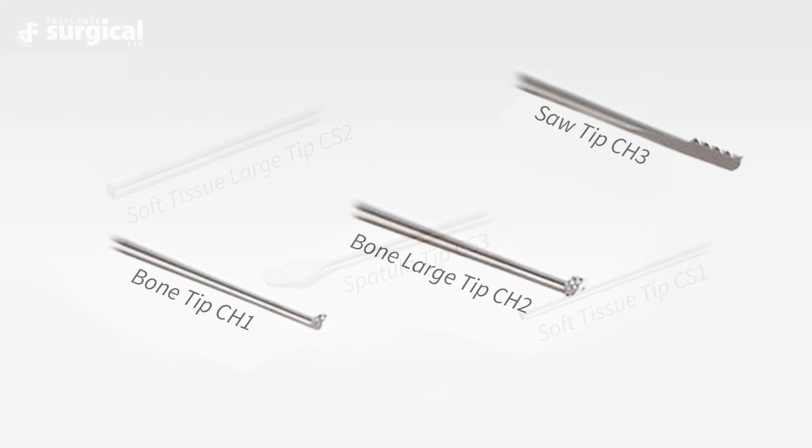For hard tissue orthopaedic surgery, there are again three different bone tip options. We have the standard bone tip, we then have the large bone tip and also a saw tip. These are denoted by CH1, CH2 and CH3 respectively on the tips of the sonotrode.